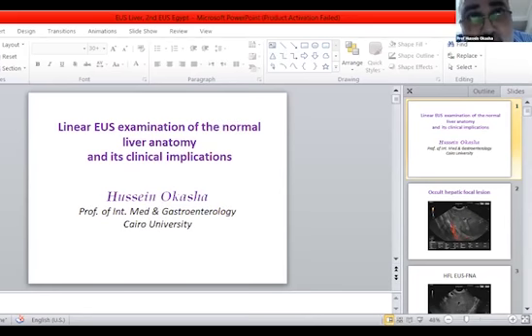But of course, you can miss an isoechoic lesion, as you mentioned. But I think the big failure of EUS to visualize a focal lesion is not the size of the lesion, because EUS can detect even 3 millimeter lesions, but the location in segments 5 and 6.